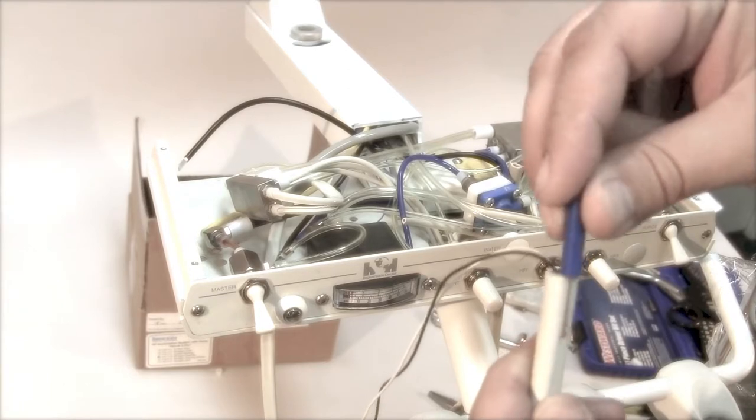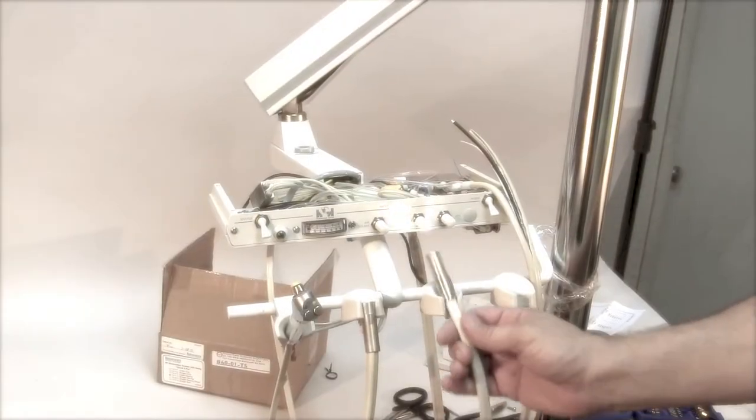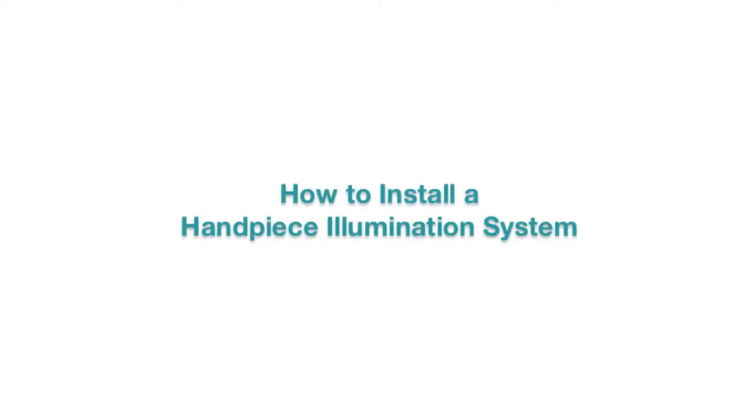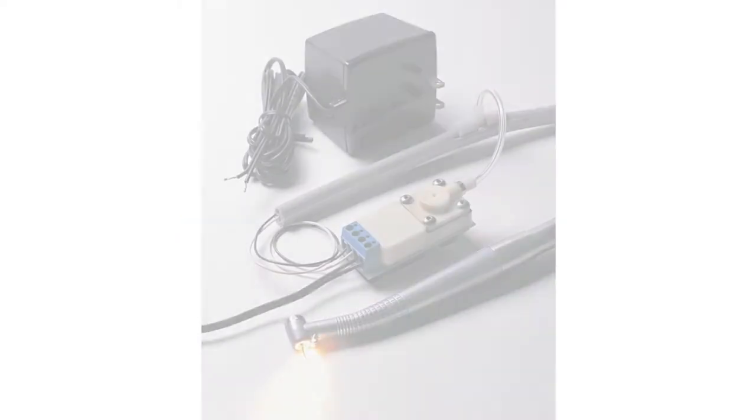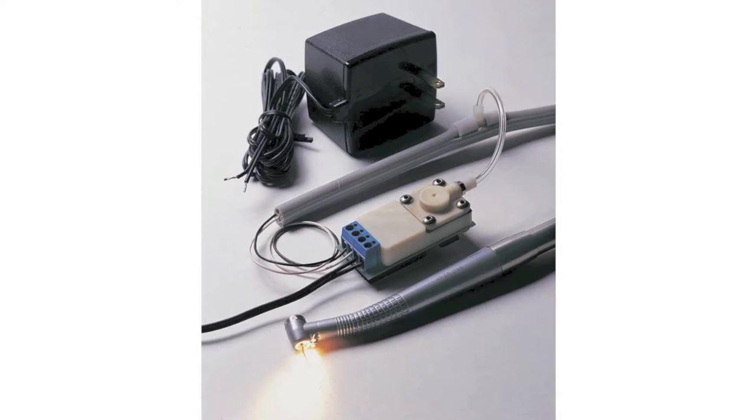Adding a bulb style handpiece illumination system to your delivery unit is such an easy affair that we'd like to demonstrate it for you. American Dental offers an economical bulb style handpiece illumination system that includes a transformer, air electric control, and tubing with bulb socket and connector that anyone can install.